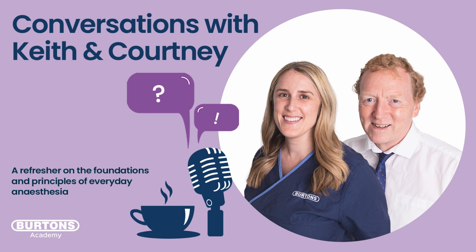But of course, if you were to have an oxygen analyzer in circuit, you could tell very quickly when you'd got to that denitrogenated state, and then you can just turn the oxygen down, rather than assume the worst, assume a long period. With that sort of monitoring capability, you could get to a reduced state a lot earlier. But we always play safe, don't we, with oxygen?